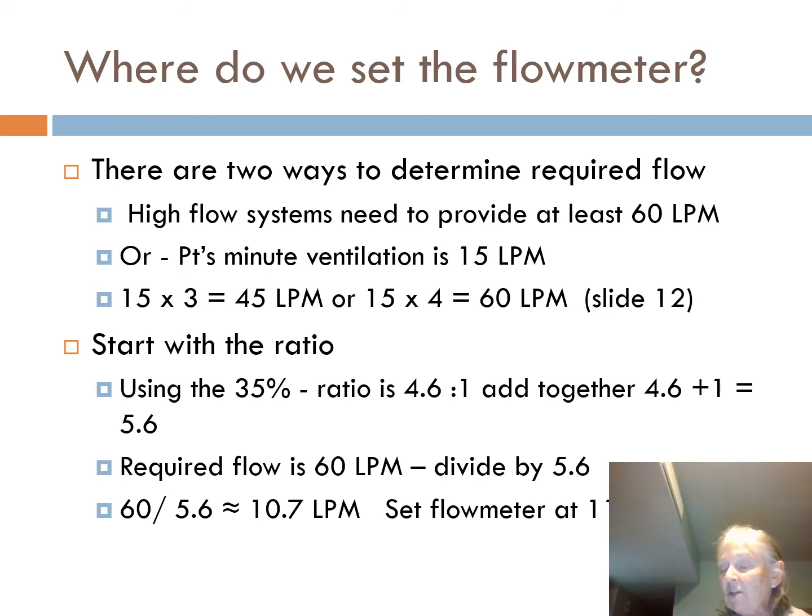And you can say, well, that's going up. That's perfect, because some patients want more than what we're delivering. If they're not happy, those patients will tell you they're not happy. And so be prepared just to either titrate up or titrate down.